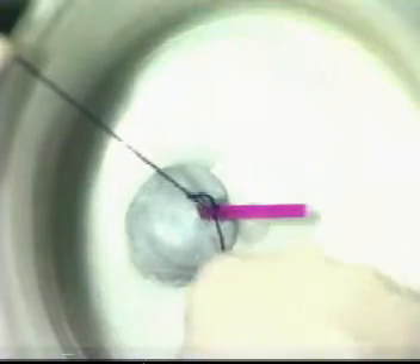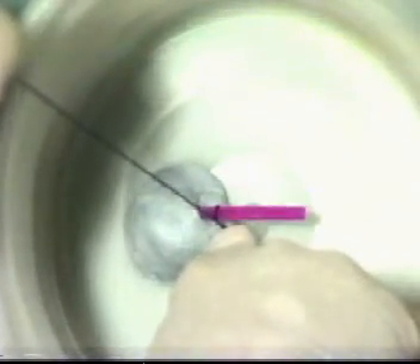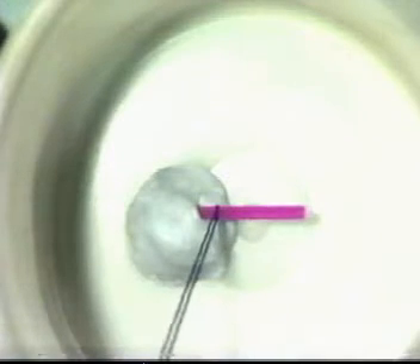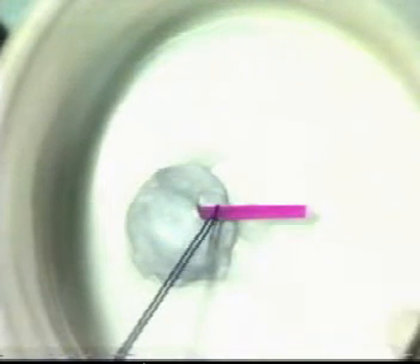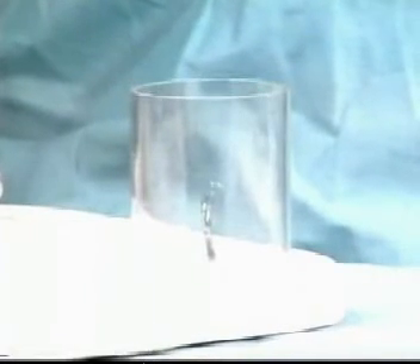Do a third throw for security and snug it down. Once complete, one is in a position to cut the suture. Ensure that no tension is actually placed on the vessel itself at any time.